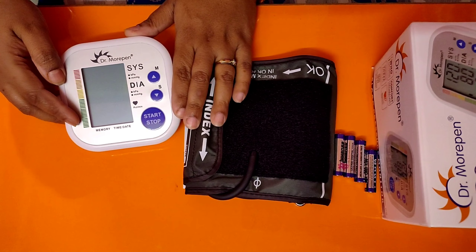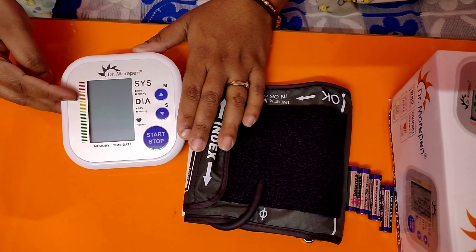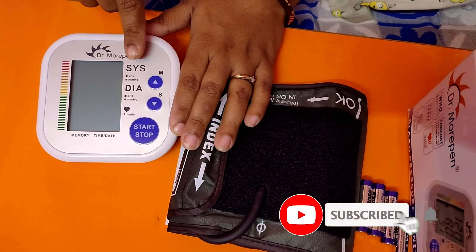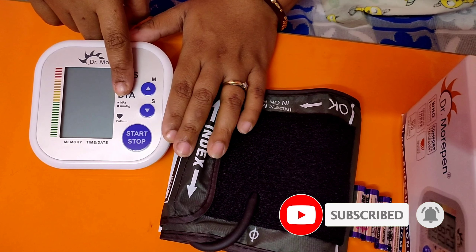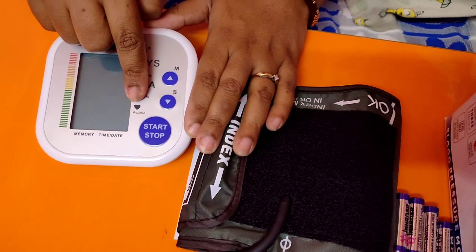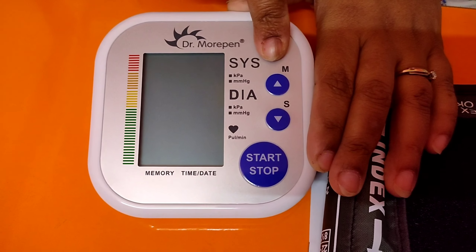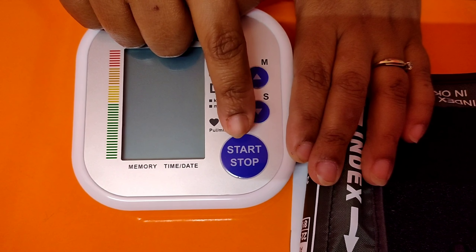On the left-hand side of the machine, there is a blood pressure indicator from green to red, that is from low to high. On the other side, there is SYS written as systolic pressure and DIA as diastolic pressure. There are two buttons — M and S — which is a memory button for previous blood pressure readings checked on that machine, and then there is a start and stop button, which is a big button.